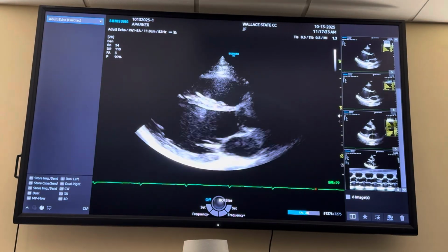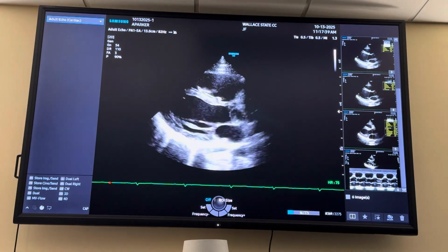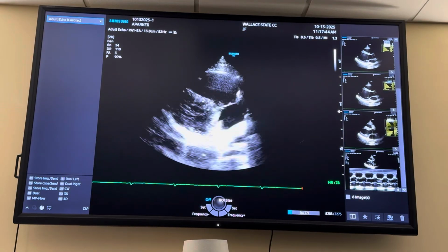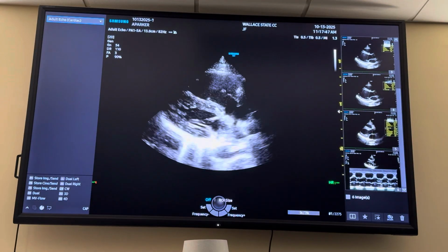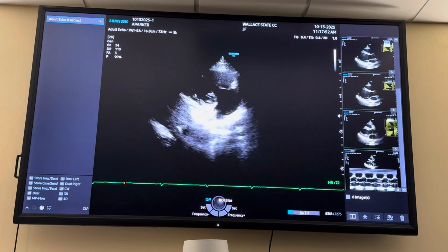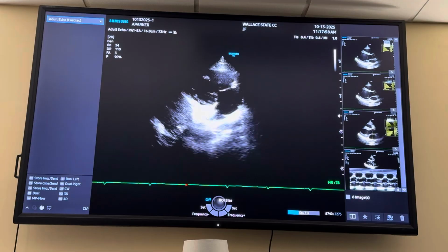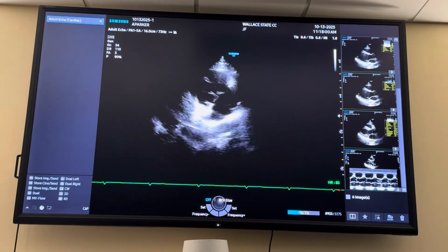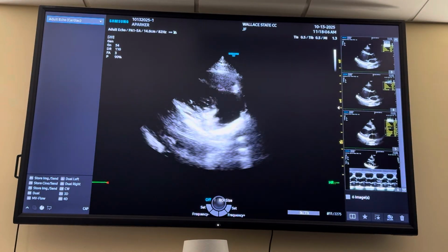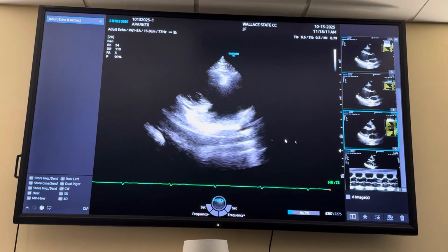Who? You? Okay. So remember we angled down for RVIT. I know it's a lot to kind of go through the protocol, but just be mindful of your depth with each step that you're moving. I had a few of these, the RVIT clip store that you took. This was a lot of what I was seeing. Yes, that's great, you're in the right window, you're taking what you need to, but you've got to make sure you increase your depth, because honestly a lot of what I was looking at, the focus was down here and then the depth.